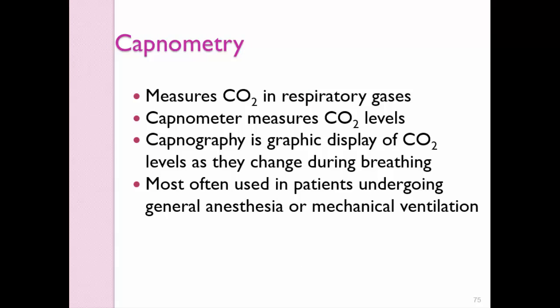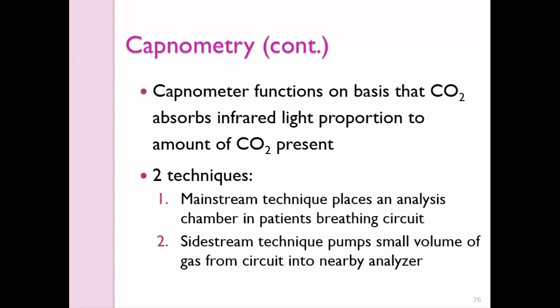Capnometry measures the carbon dioxide in the exhaled gases. The capnometer measures the levels. Capnography is the graphic display of carbon dioxide levels as they change during breathing, most often used in patients undergoing general anesthesia or mechanical ventilation. And again, you use the infrared light absorption to get this accomplished. You have a mainstream technique, which places an analysis chamber at the patient's breathing circuit, and a sidestream technique, which pumps small volumes of gas from the circuit into a nearby analyzer.